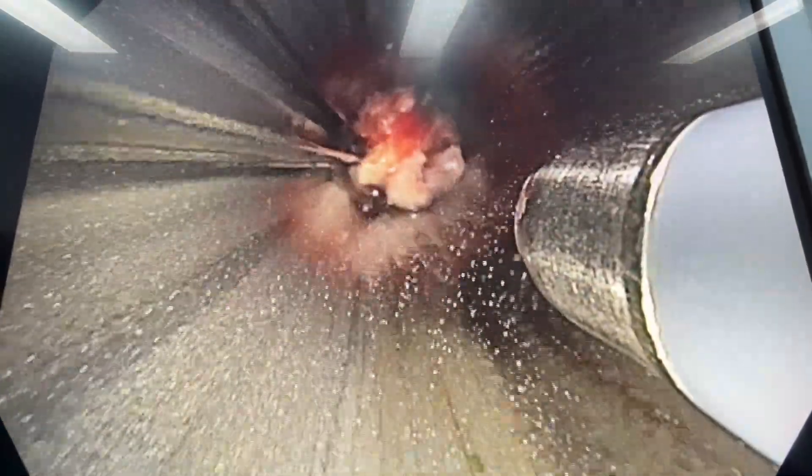Once again a bit of it fell off and remained in the rigid scope, so I'll just grab that again. I'll freeze for a bit longer this time just to make sure it really sticks. And you can see now I've completely removed a large amount of tumor.